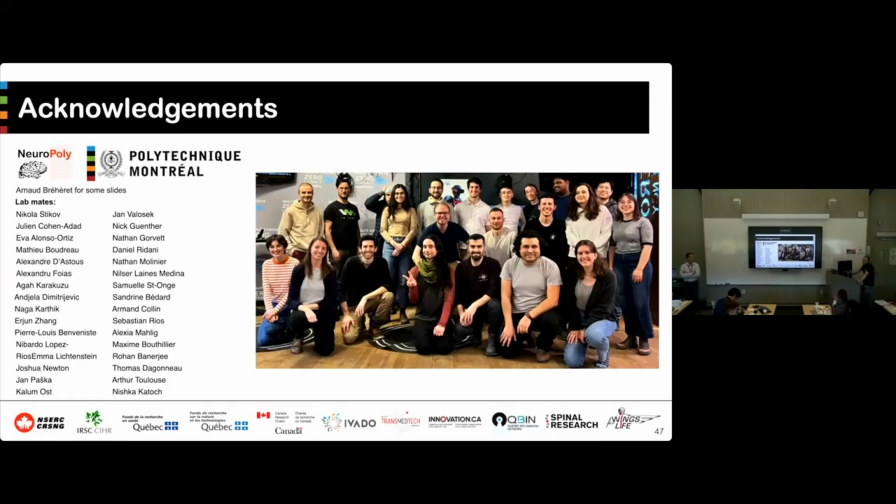So we're not one volume behind. During the shim acquisition, the sequence is going to fetch the latest value from the PMU, and there is a delay, but it's really small. It's a few milliseconds. Okay.